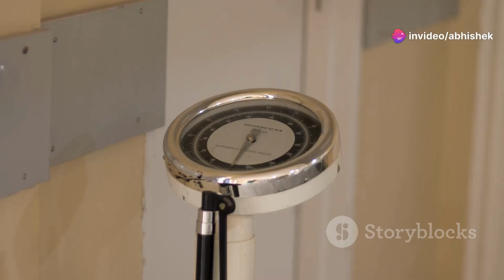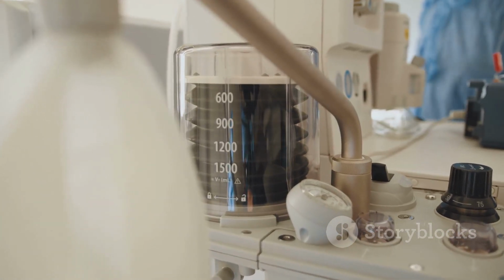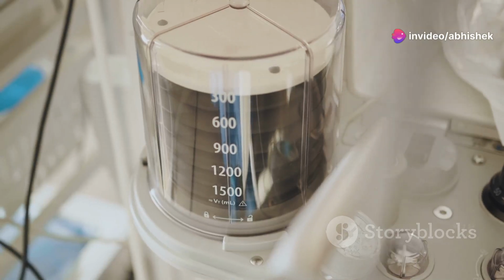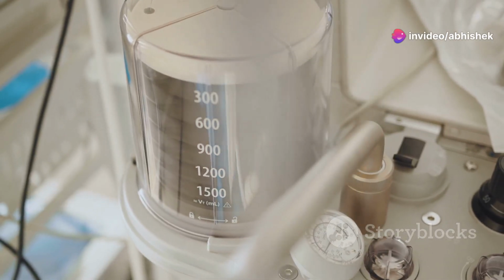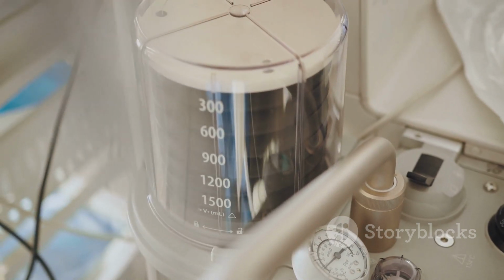Now, we can't just have these gases flowing freely, right? That's where flow meters come in. These handy devices allow us to precisely control the flow rate of each gas, ensuring the patient receives the optimal mixture for their needs. We measure these flow rates in liters per minute, and trust me, getting that mixture right is crucial for a successful surgery.